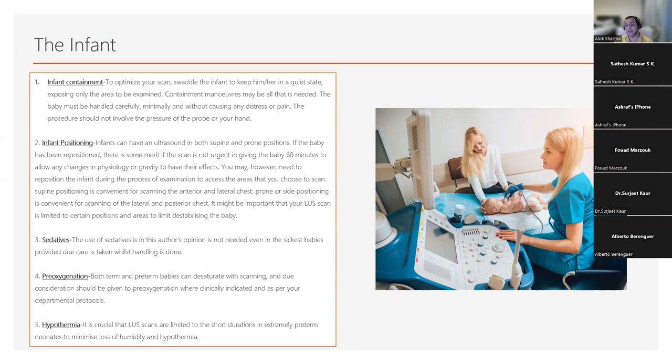Now, that governance might say that you have a pneumothorax in a deteriorating baby. If you have a tension pneumothorax, that's a clinical diagnosis that you're going to make on transillumination. Really, it's not a diagnosis where you wait for a chest x-ray. But a lung ultrasound can be extremely helpful, provided the baby's stable enough and gives you time to do it. It is more sensitive, more specific. Now, the question is, do you have the confidence to then store those images and needle or do an appropriate chest drain as an intervention based on your lung ultrasound alone? And your guidelines and your standards need to address these aspects.